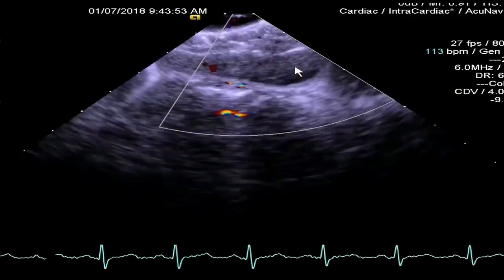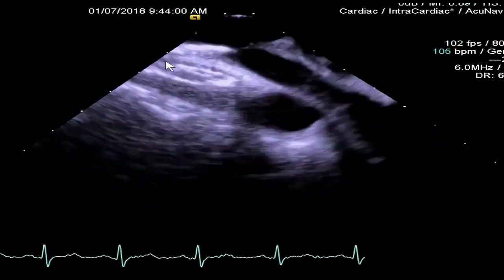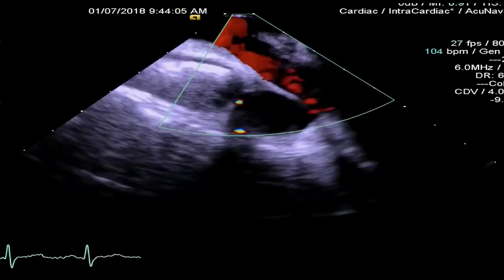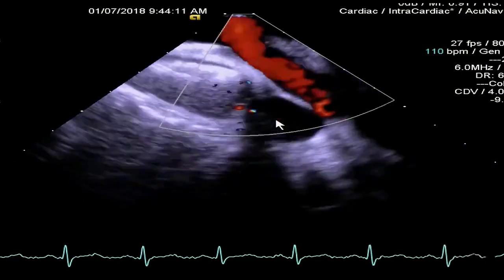Yeah. Rotating. Yeah, that is the posterior margin which has gone in. And this superior vena cava, when you are seeing posterior to the superior vena cava, that round structure is the right pulmonary artery. What Dr. Ramya is showing with an arrow is the right pulmonary artery.